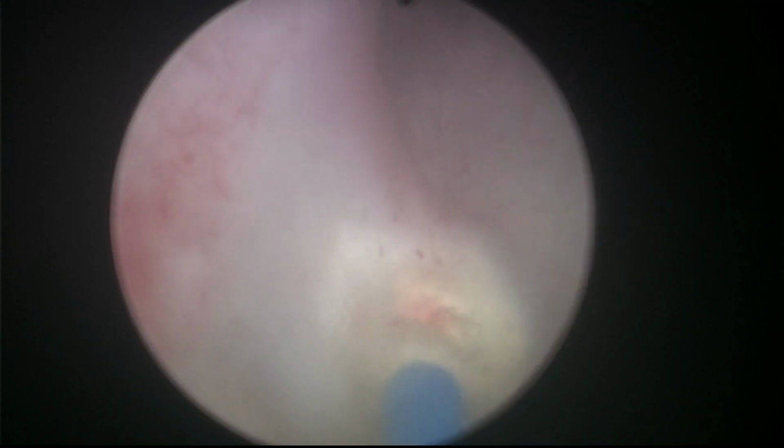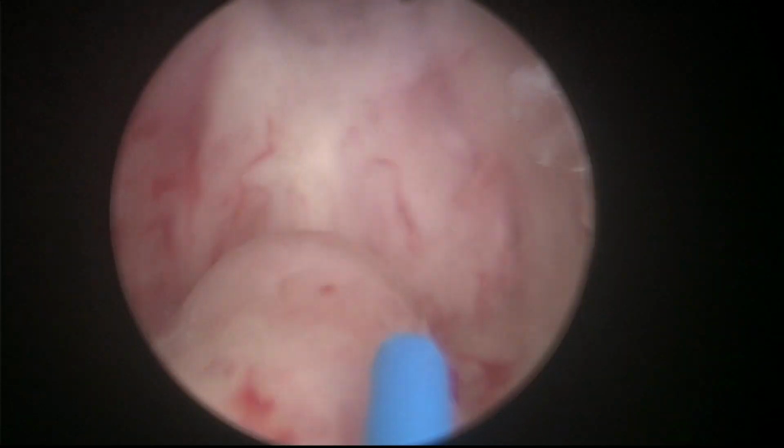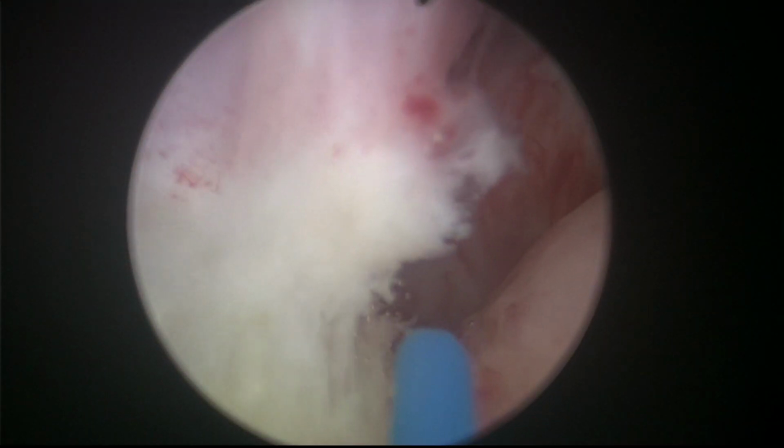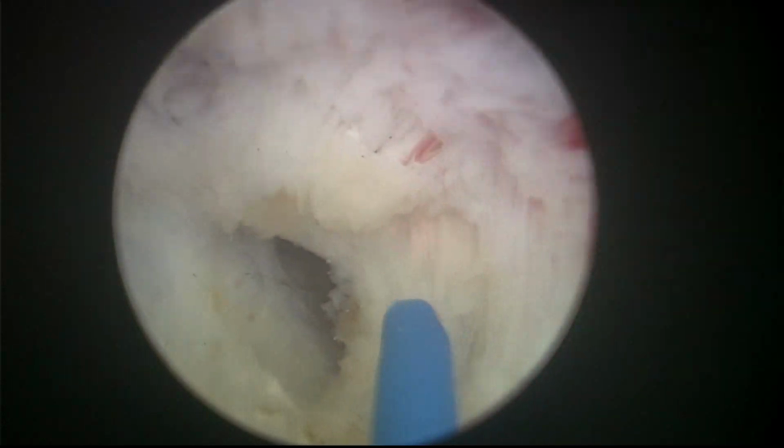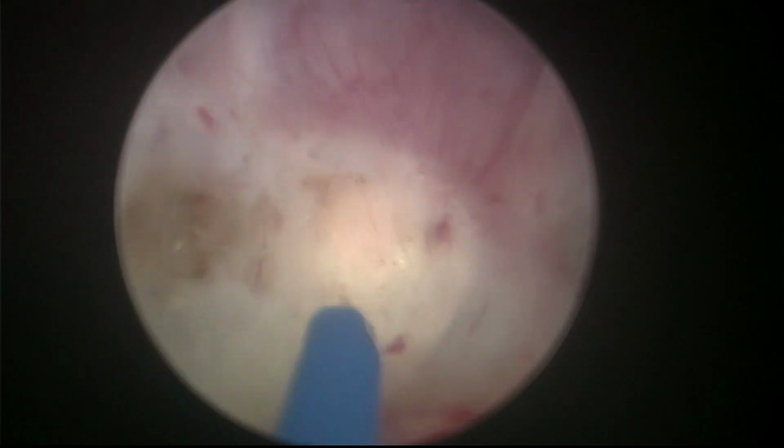And here, what I'm trying to do is delimitate the white line at the apex. Sometimes in these cases, the anatomy is somewhat distorted, and well, you have to do your best to understand. But I have to say that when you do En-bloc HoLEP, which is always following more or less the same steps, it becomes easier and easier to treat these cases.